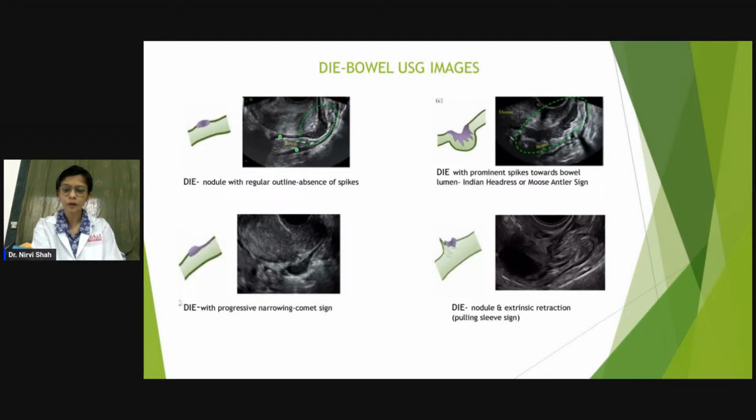Okay, also, one more important thing: if there is deep endometriosis, always extend your sonography, do a USG abdomen, and just check the kidneys and ureters. Just rule out hydronephrosis. TVS for deep endometriosis does help. TVS helps in planning for the surgery too.